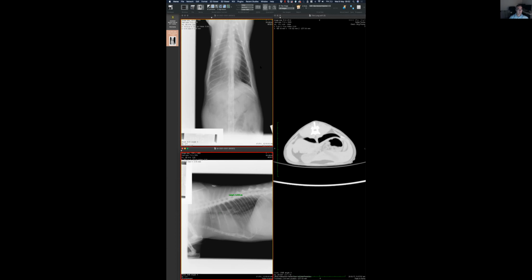Subtle, but it's there. Just as an aside, Mariana, did this cat have the ultrasound at all, or did it just go straight to CT? I think we diagnosed it with the ultrasound, but the idea of the CT was to know exactly where the rent was for the surgeons to plan the surgery. I remember we knew about the tissue. I was very confused about this, and then we put the probe, and then everything came into place.